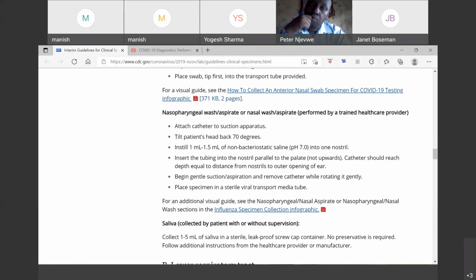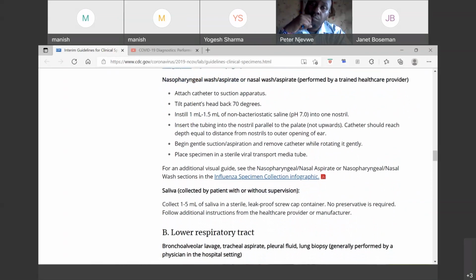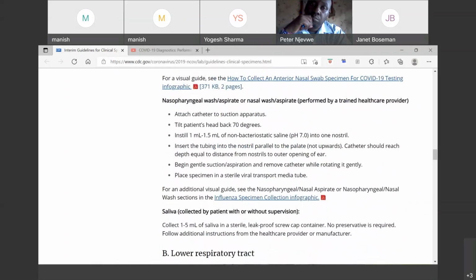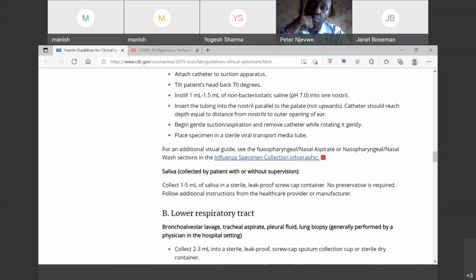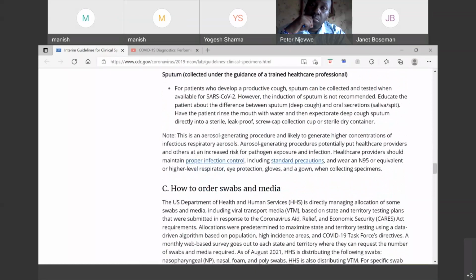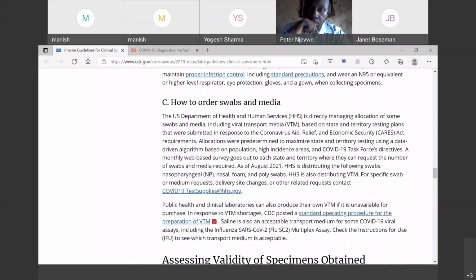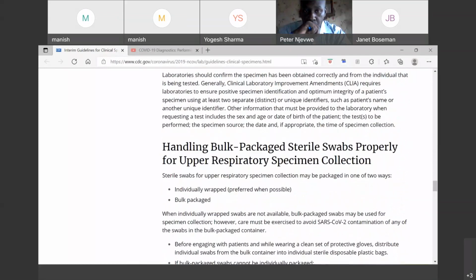That is okay. It is again testing and all procedure. This is wash and all. This is lower respiratory tract. This is how to order swab and media, which may not be relevant to us because the government will provide us the entire kit and all.